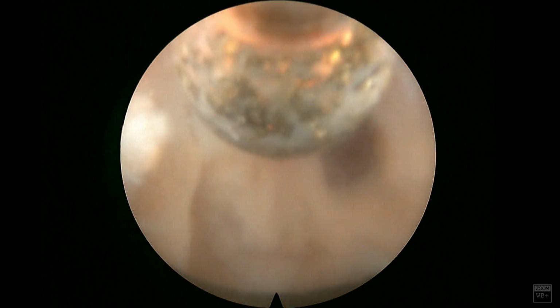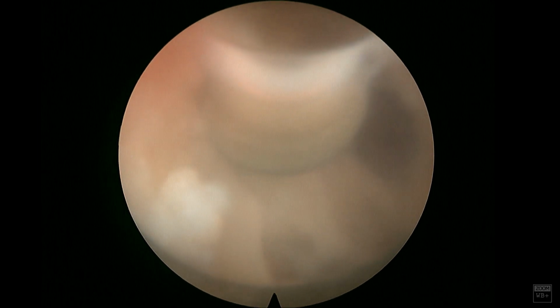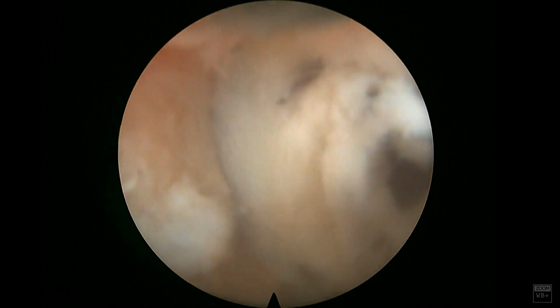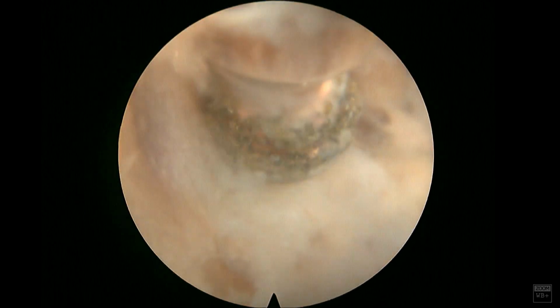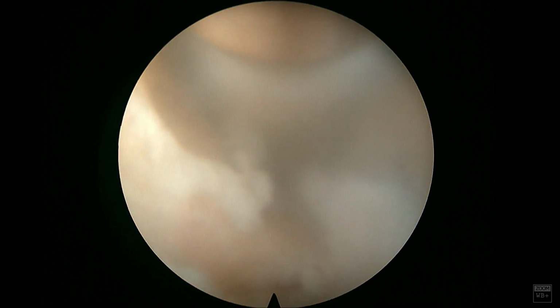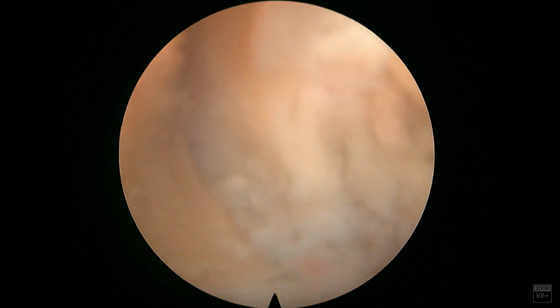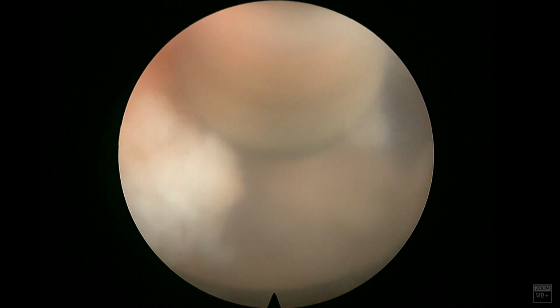Again, trying to remove some of the lamina, the L5 portion. And so again, I'm trying to remove the bone around it as much as I can so I can remove the osteophyte en bloc. And you can see that the ligamentum is starting to thin out here, so this is probably as much of the decompression as I want to extend caudally. And so you want to annotate these areas when the ligamentum thins out, because that's a marker to give yourself on the location of where you're at within the spinal canal.